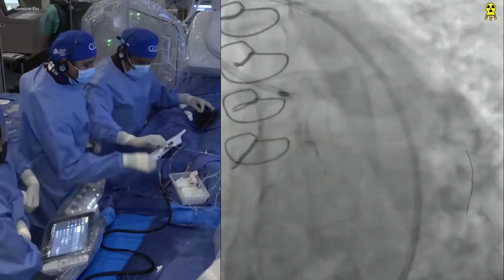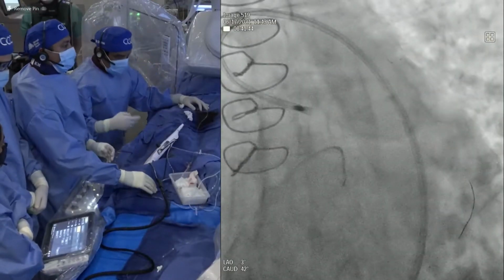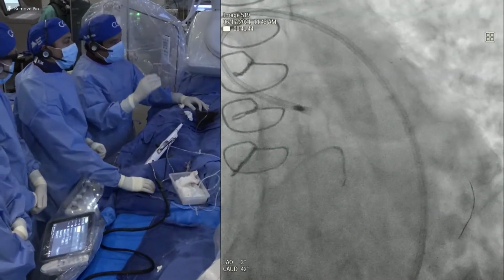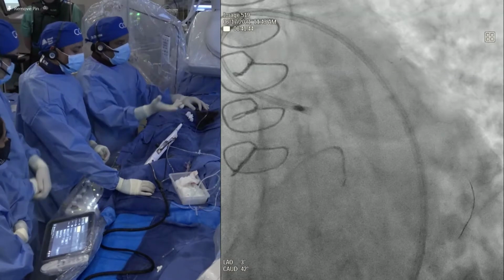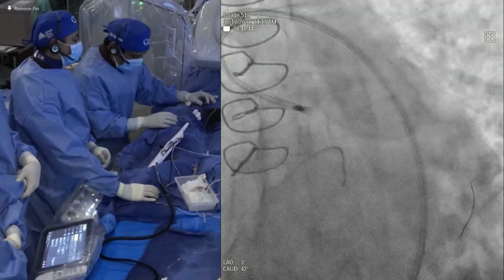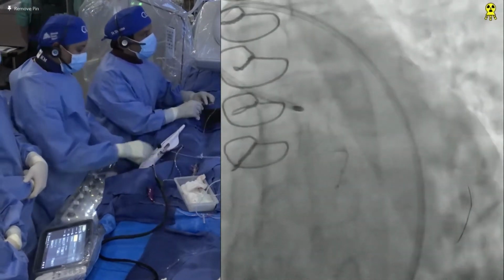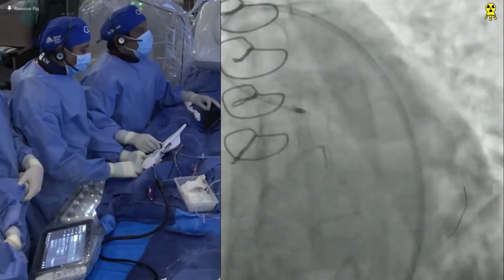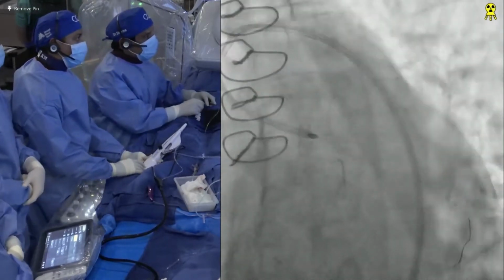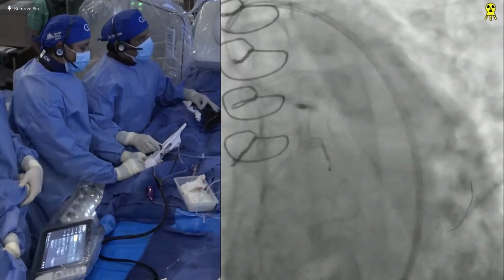The key is that even if you don't go completely, I know there are enough data now. They have seen that the stent gets ablated, because you see the microparticles in vitro, and otherwise also by OCT after the rotablation. So you really create cracks, or of course the polymer is all gone. Here with the 2.15 we'll be very careful. We want to make sure we do our 3 things back and forth.